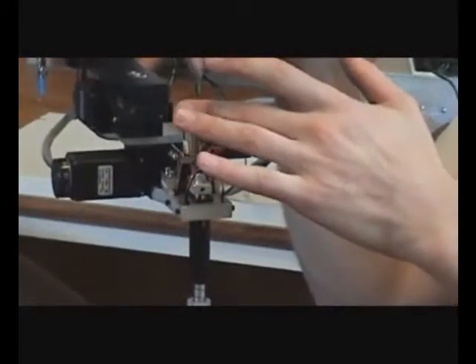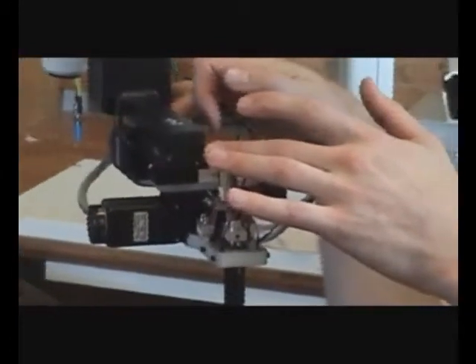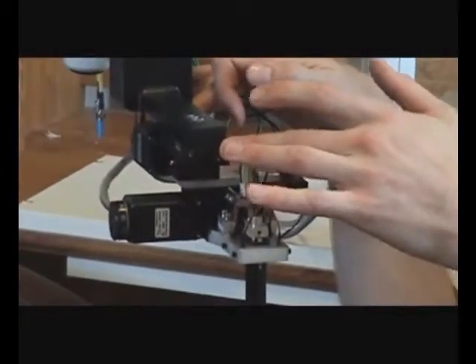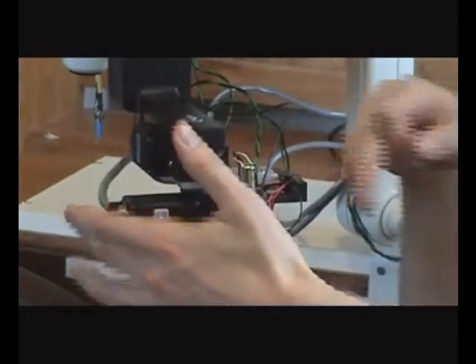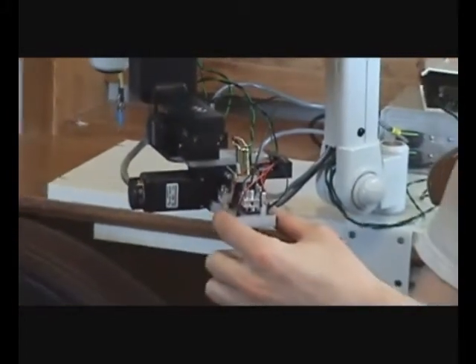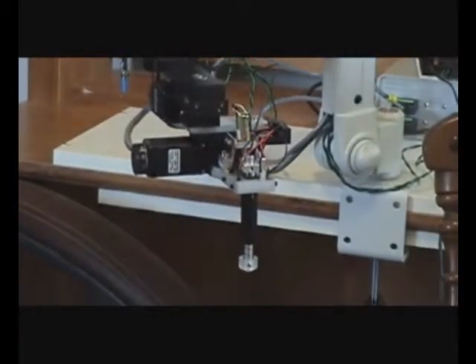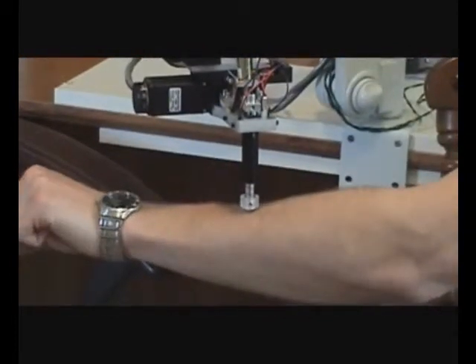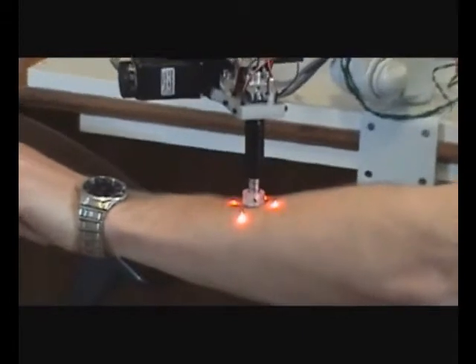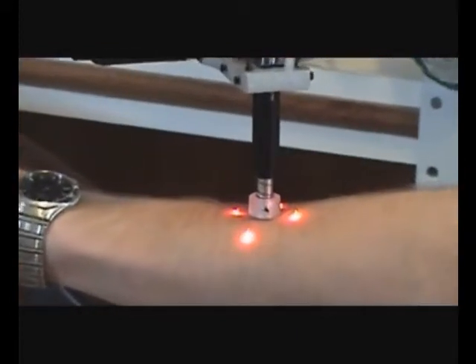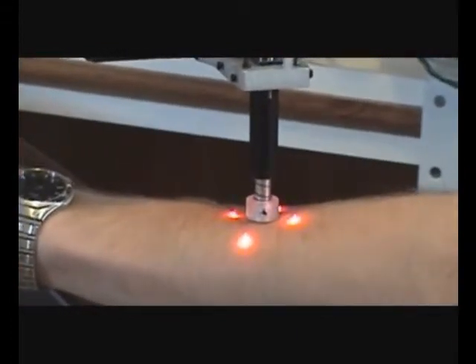We also have two motorized stages from a company called Standa. They use stepper motors in XY configuration. And here we have four lasers, micro laser diodes, which as needed, they illuminate the area that is to be scanned. And these are spaced by 25 millimeters.